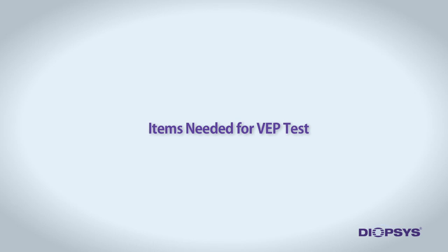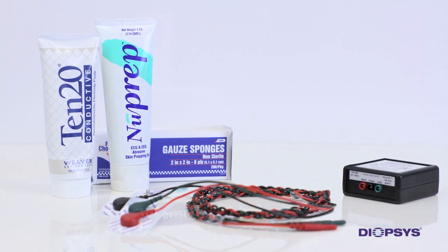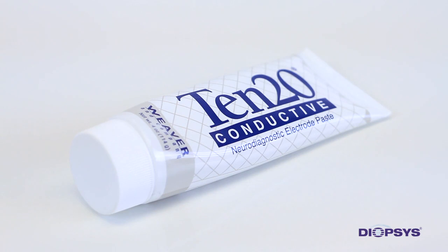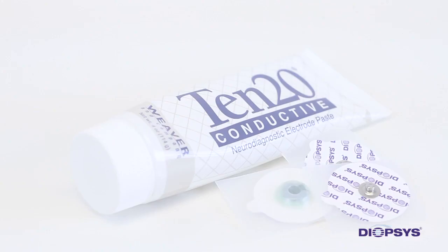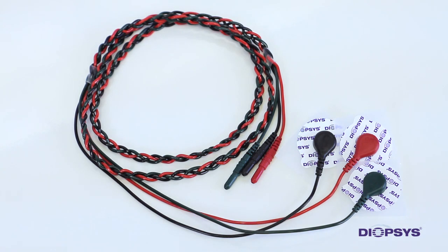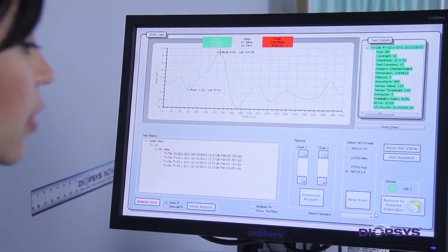To save you time, it is helpful to have all testing supplies within arm's reach before bringing the patient into the testing room. Be sure to have the following items ready: clean gauze, the tube of NuPrep gel, the tube of 10-20 conductive paste, three disposable EEG electrodes, and the VEP lead wires. We advise attaching the electrodes to the three lead wires ahead of time for easier patient prep. Properly prepping the patient for the VEP test is one of three important steps in the testing procedure, since proper electrode application is crucial in achieving quality test results.